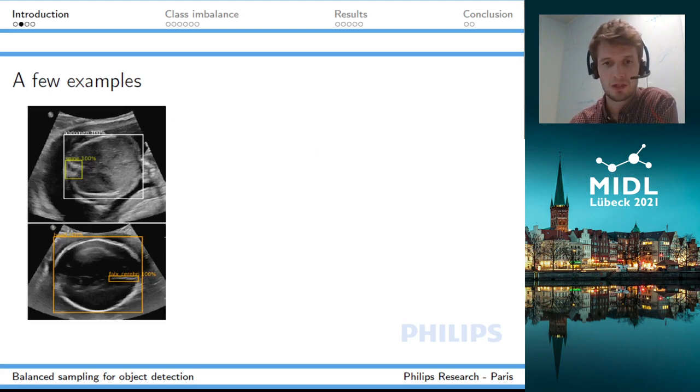Let me show you a couple images in our dataset. We are looking at 2D ultrasound images of the fetus. You can see here on the top image an abdomen of a fetus in which you can also see the spine, and the bottom image is an example of the head in which you can see a substructure called the falx.